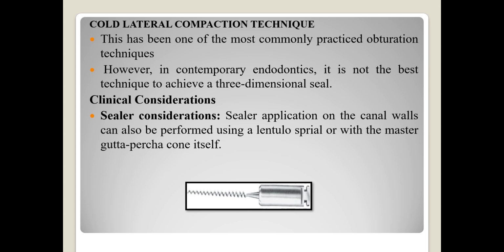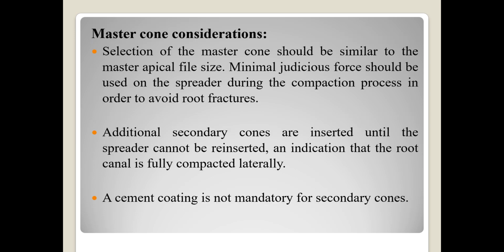First, the lateral compaction technique. It is one of the most commonly practiced obturation techniques. However, in contemporary endodontics, it is not the best technique to achieve a 3D seal. Clinical considerations. Sealer consideration: sealer application on the canal walls can be performed using a Lentulo spiral or with the master gutta-percha cone itself.